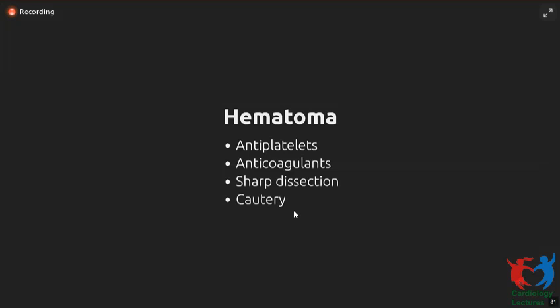Prefer to use cautery, and compared to regular patients, where small bleeders you might leave alone, here you obsessively catch all the small bleeders, see that everything is cauterized well, there's no small ooze when you close. And again, like I mentioned before, don't be afraid of sharp dissection. Blunt dissection tends to produce more bleeding. If you do sharp dissection, stay in fascial planes, bleeding tends to be less. So with that, I'll stop.